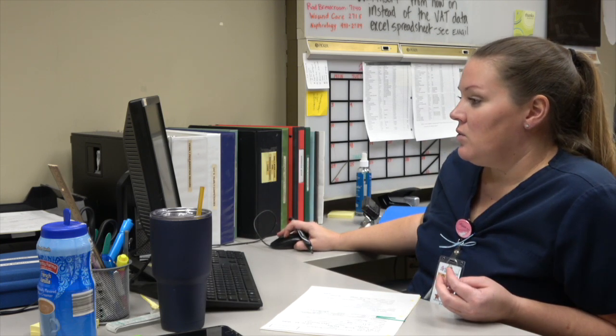Just knowing that it was safer to place a PIC than it would be safer to place some kind of central access. So we're just going to look through this patient's history, see what kind of surgeries that they've had. Anything specific to the surgeries that concern you? It just depends on what kind of surgeries they've had. A shoulder surgery or something in the chest, anything like that. Look for pacemaker. What about lymph node dissections?